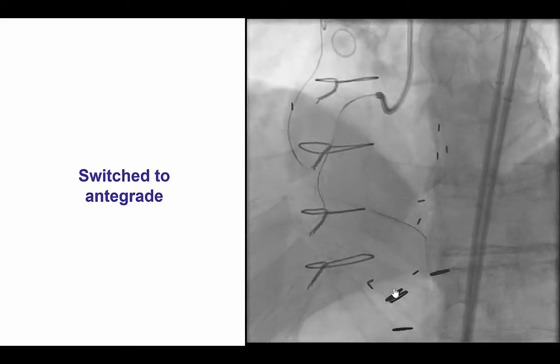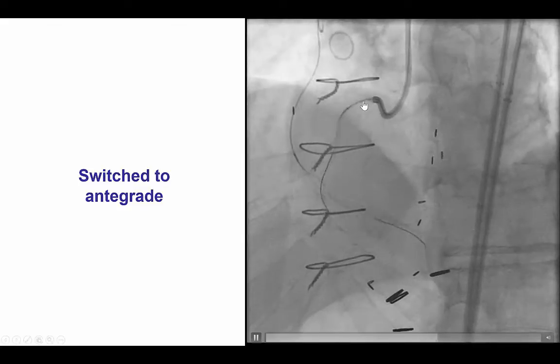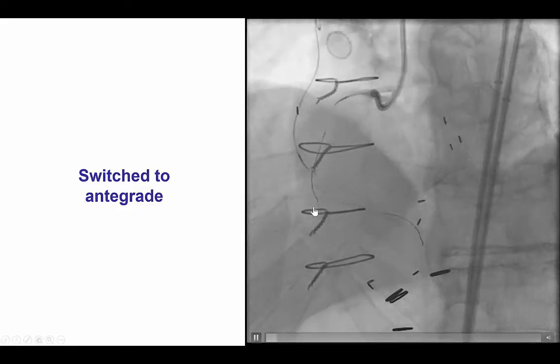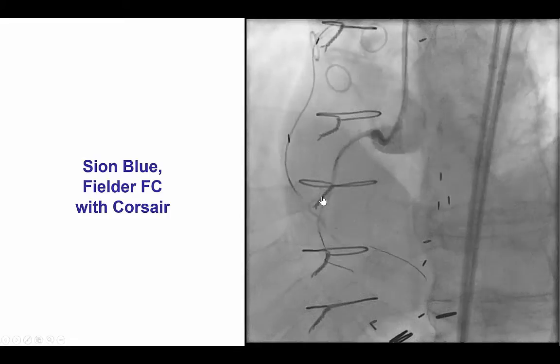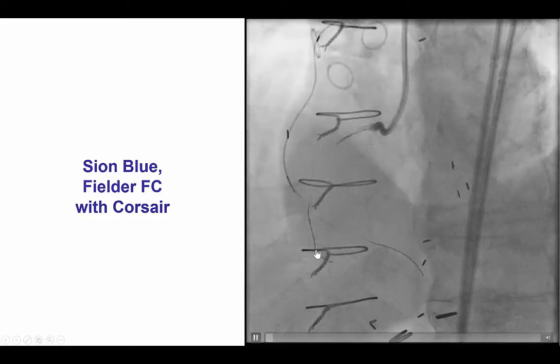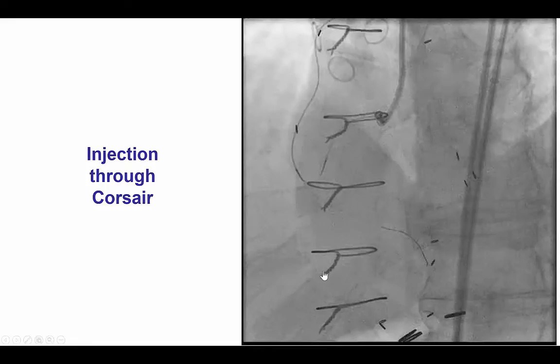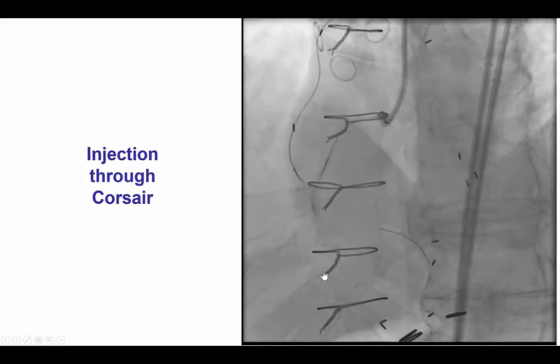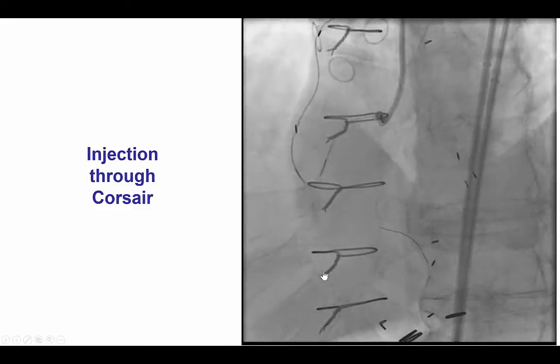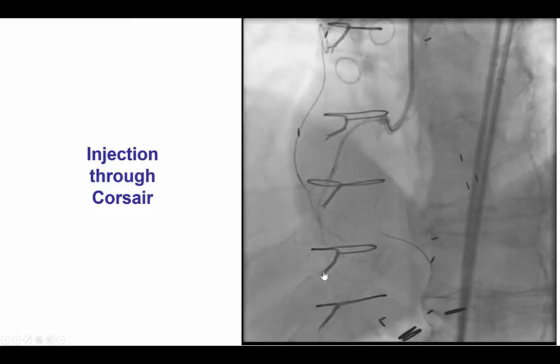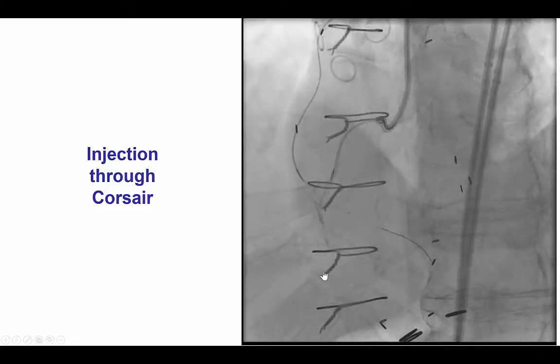As a result, we decided to try an antegrade crossing attempt. We advanced a second Corsair antegrade and then tried to localize the proximal cap by doing various injections. The wire of course wants to go preferentially into the large acute marginal branch. We did some localized injections through the Corsair trying to better understand the anatomy, but it was still hard to separate the origin of the occlusion from the takeoff of the marginal branch.